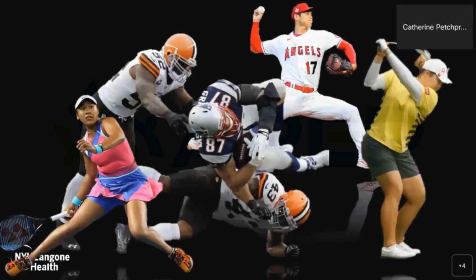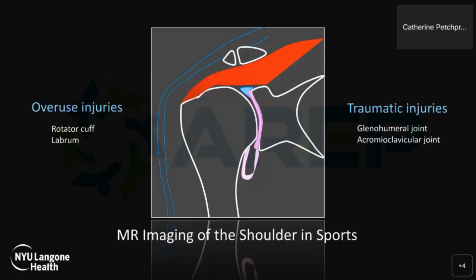In conclusion, shoulder pain is common in athletes and non-athletes alike. Today, we reviewed the most common overuse and traumatic injuries of the shoulder and how MR imaging plays a role in the diagnosis and management of these patients.